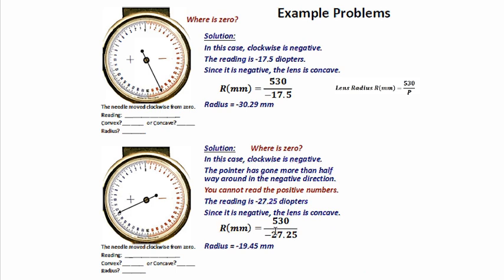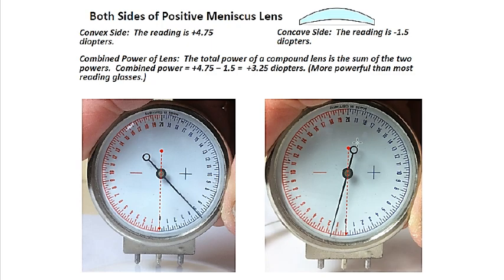You have to make sure which diopter gauge you're using, because this one is completely different from this one. Look at this.